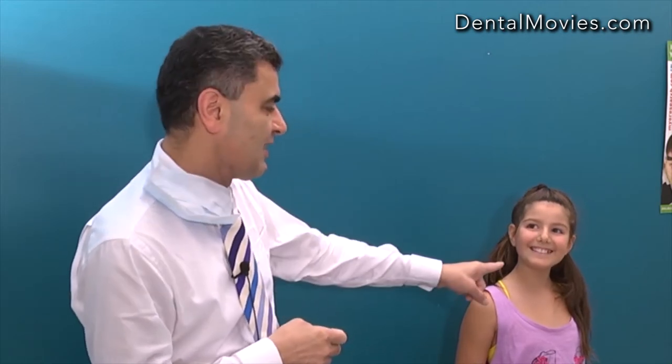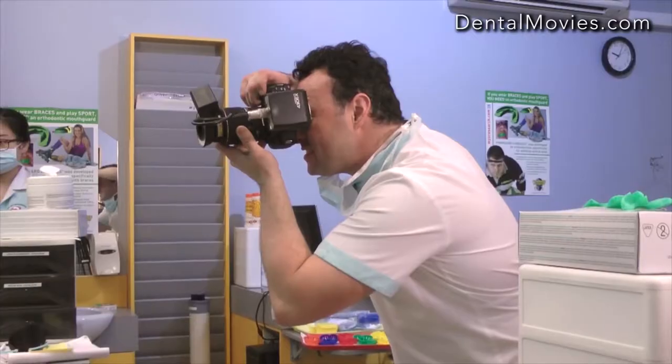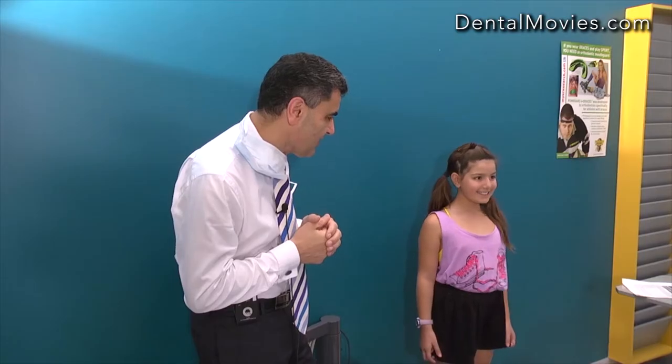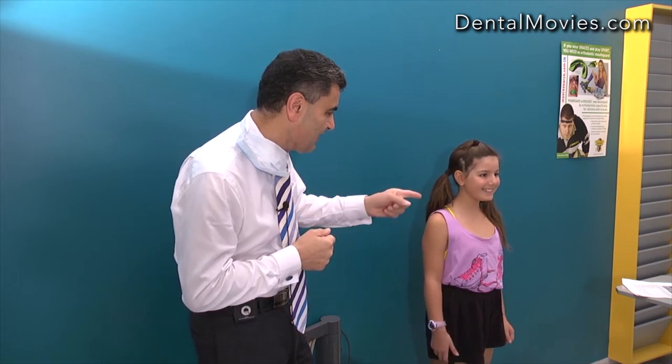Then we take the same photo again but with a big smile. We want a natural, genuine smile — asking the child to think of something funny and give a big laugh produces the authentic expression we need for diagnosis.